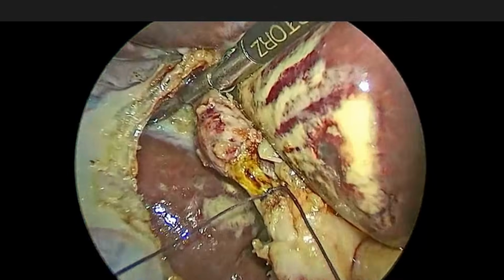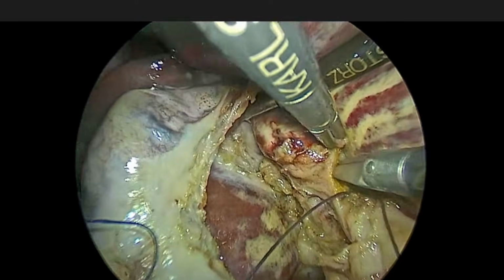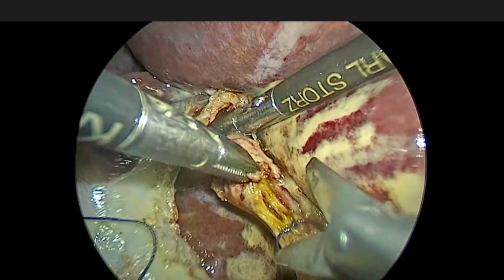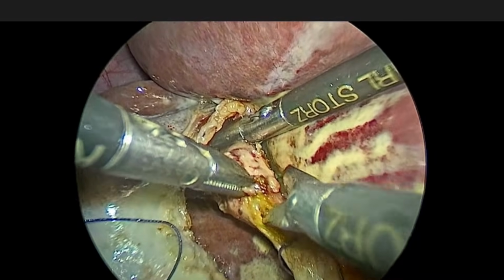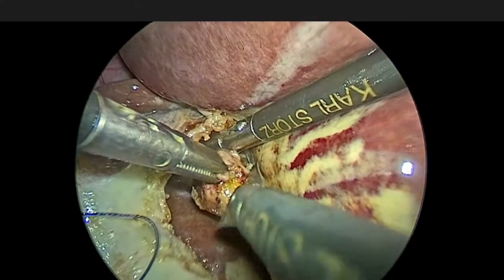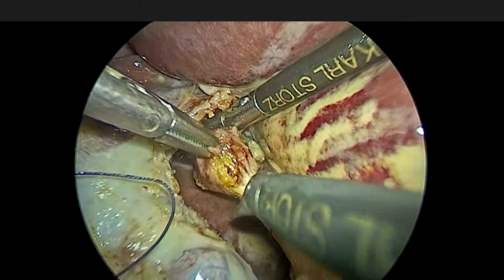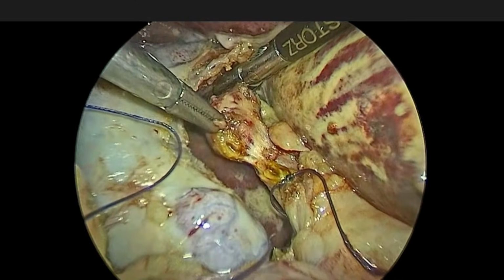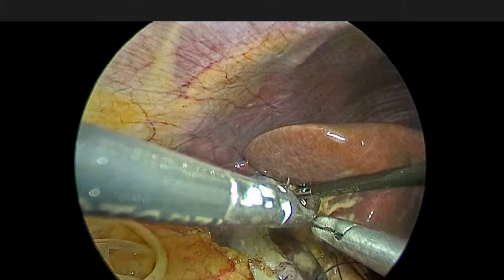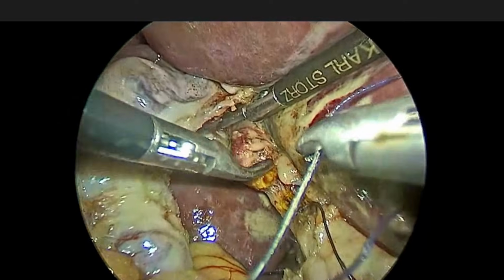We did not complete the ligation, just half of cystic duct wall was tied, and now we are dividing the gallbladder from cystic duct by sub-seromuscular dissection, and now cystic duct is completely separated from the gallbladder lumen, and we are now completing the ligation.